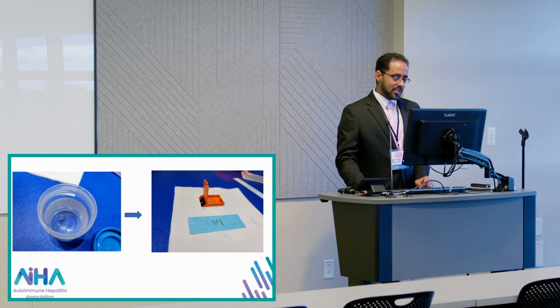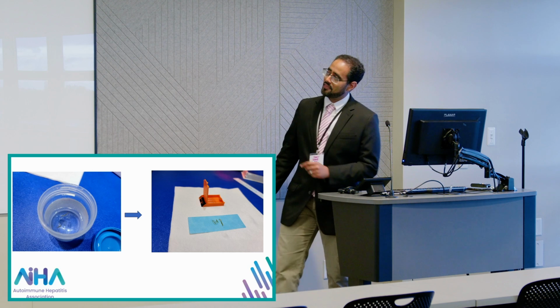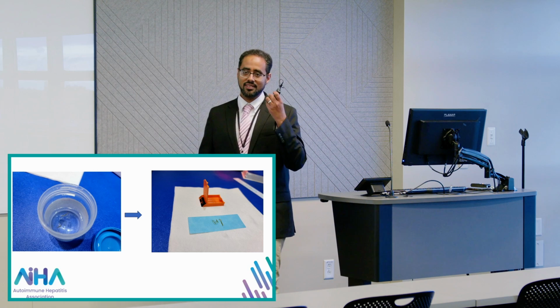So this is my pointer. I hope you can see my arrow, which is the best pointer I have now. If you can't see it, then on the left is the container. Am I going to mess up your speaker if I move? You can carry that. Okay.